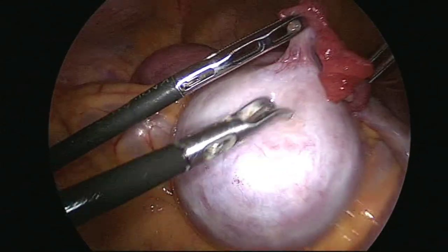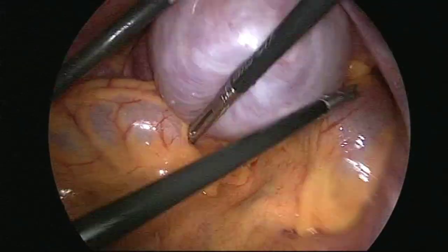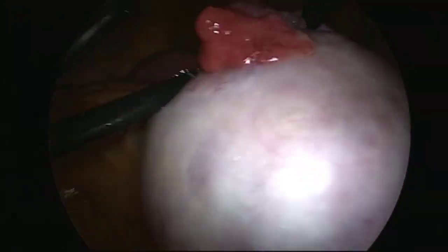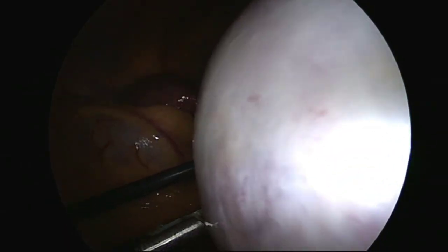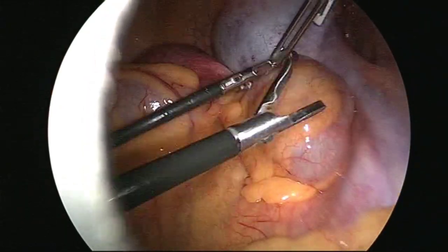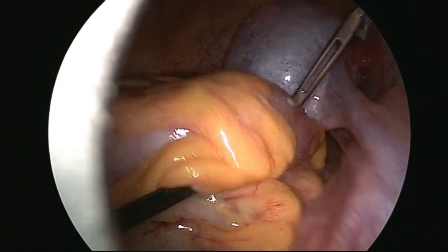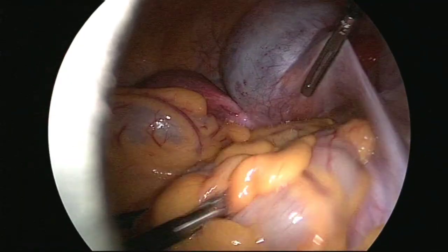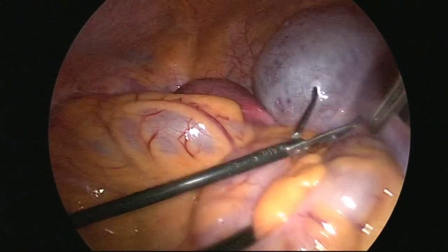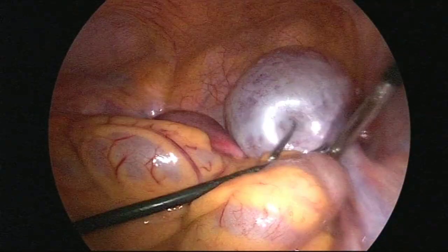The fallopian tube. And in the ovarian fossa, intestine is going. I have to remove that intestine so that I can identify any ovarian tissue there. Yes, now we can see that there is no other ovarian tissue behind this cyst, and in this cyst the complete ovary is involved.